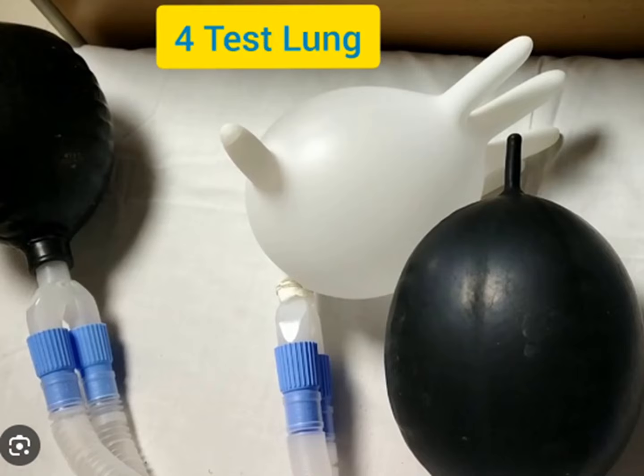And it's a good way to learn how to set a ventilator and how to move between it and adjust it while the patient's being ventilated. And really, you can do this when there's no patient in theatre. So there's no excuse not to have learned how to run the ventilator.